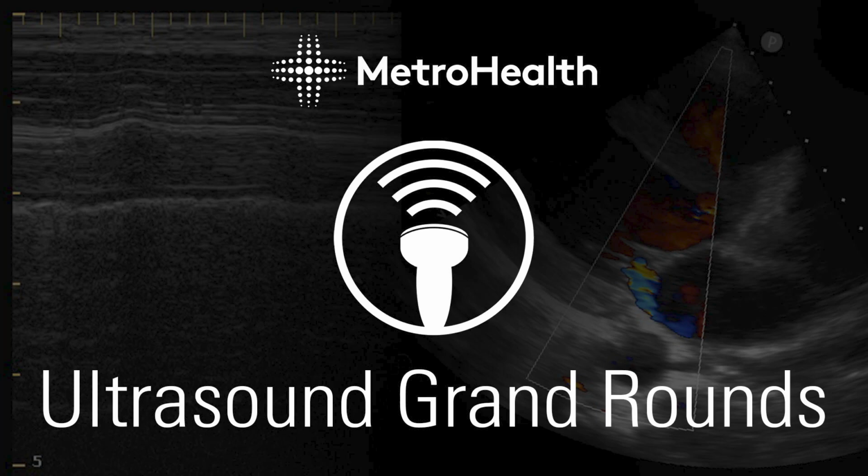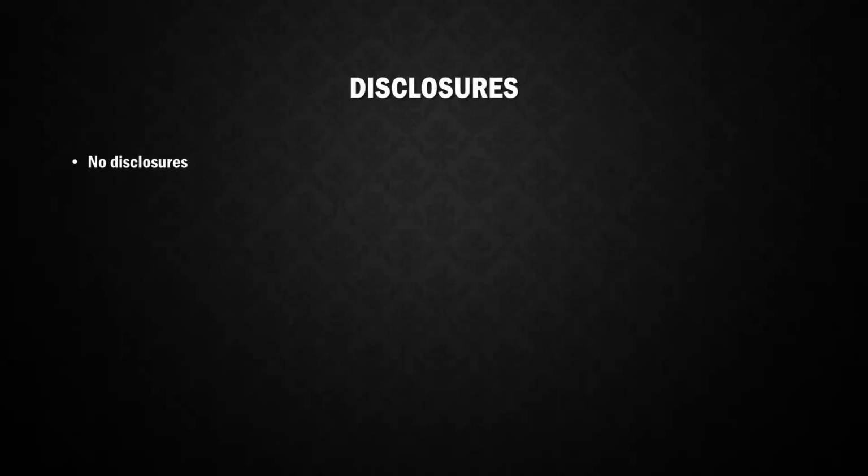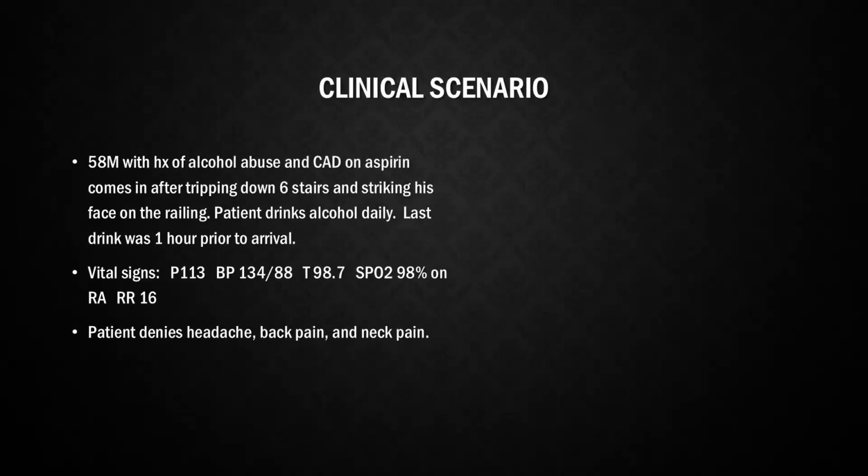Today we're going to talk a little bit about ocular ultrasound. I have no disclosures. So let's start off with a clinical scenario.